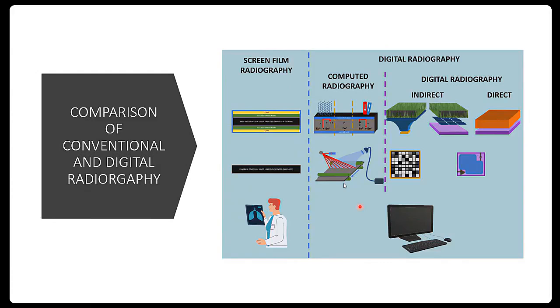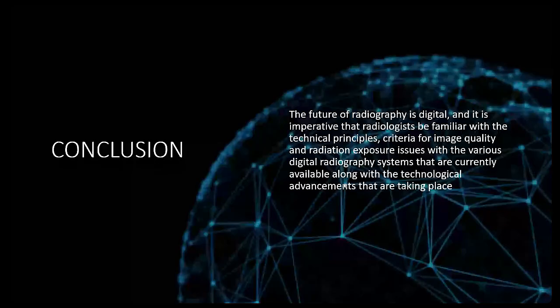And then we talked about PACS. So PACS is a networked group of computers, servers, and archives that can be used to manage digital images. And DICOM was the accepted format for digital images. DICOM is a standard that allows imaging modalities and PACS to communicate in the same language. Okay. So this is all about today's class.